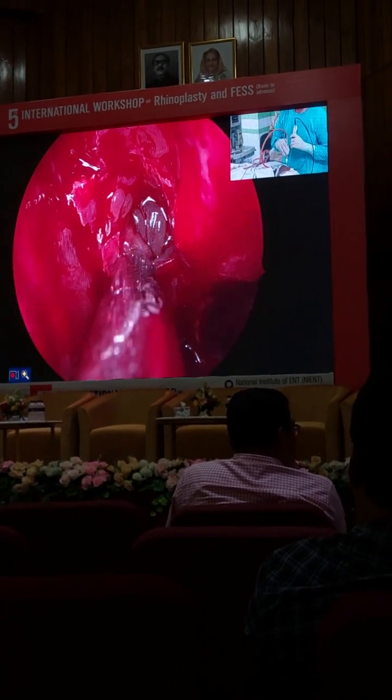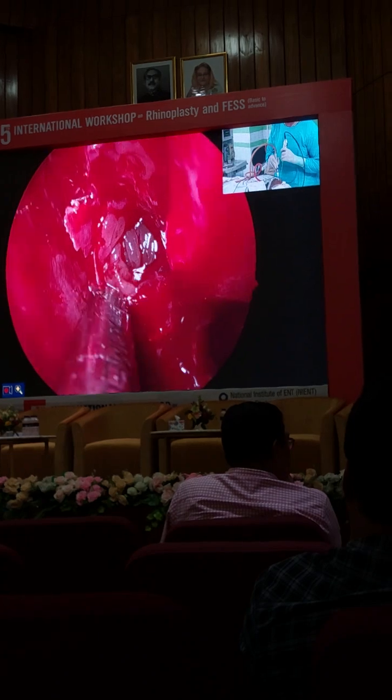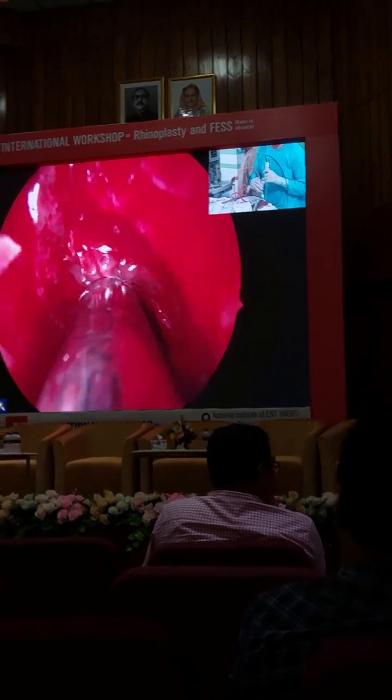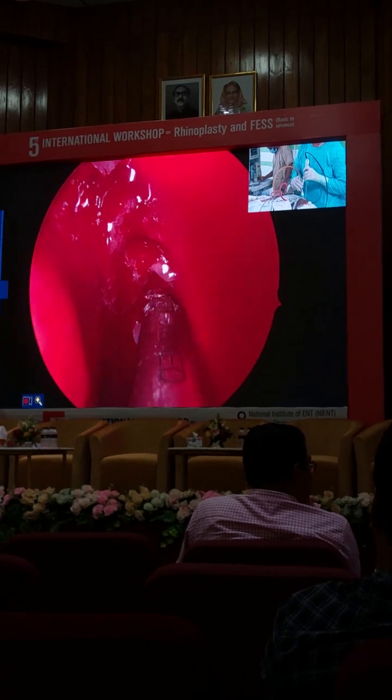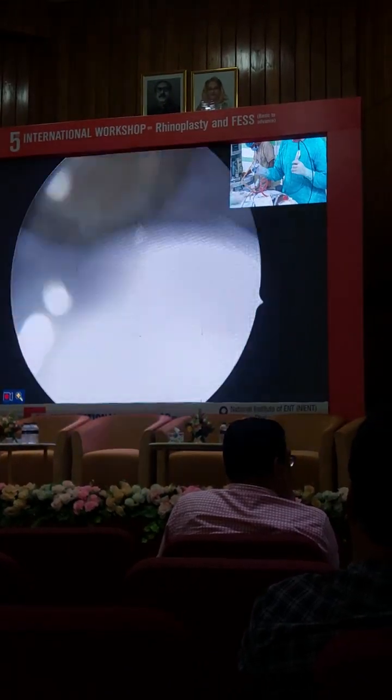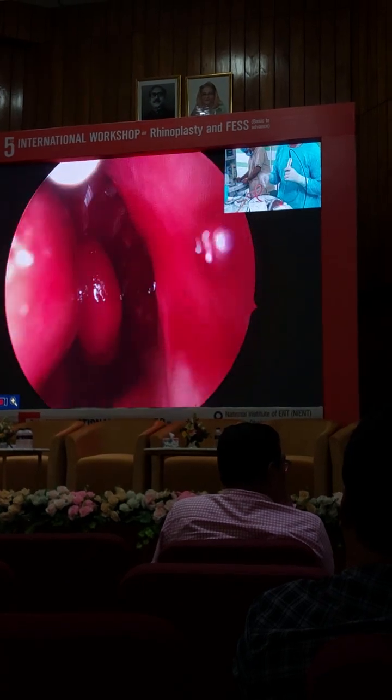When I use a zero, to go to the lateral parts is more difficult where I don't have the angle. So if that 40 is clear, then I'll go back to 40. It's more comfortable for 40.